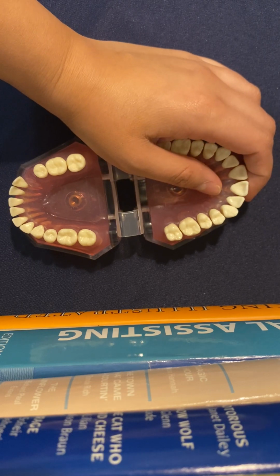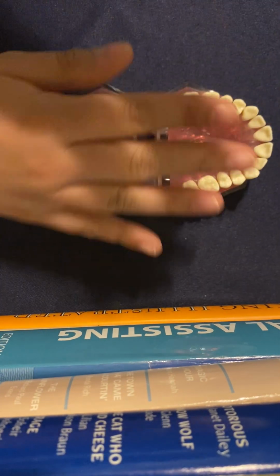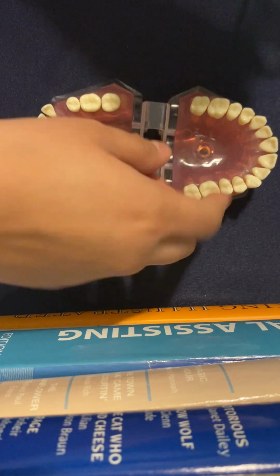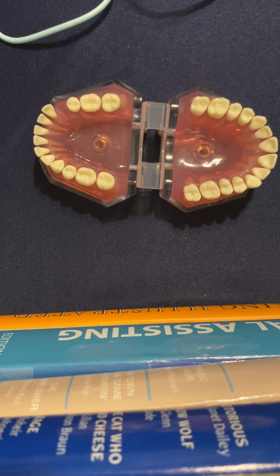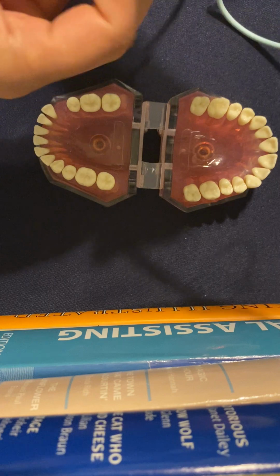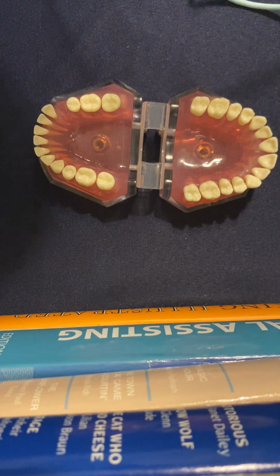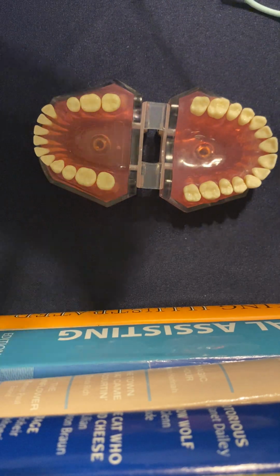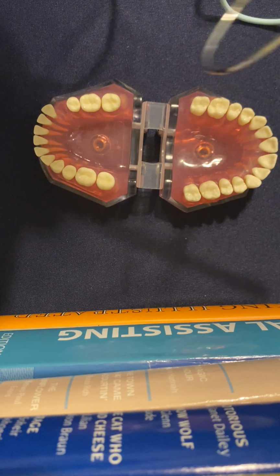Number 11, I'm pretty sure we're on. Maxillary left premolar. So I think at this point, I'm going to have to switch this out, because if I do the maxillary left, the cord will be going back down our throat. So I'm going to switch this out real quick. Well, not switch it out, but you just have to, okay. That or I did switch it out and I forgot. Actually, I can't. It's late at night. I'm sorry. There we go.